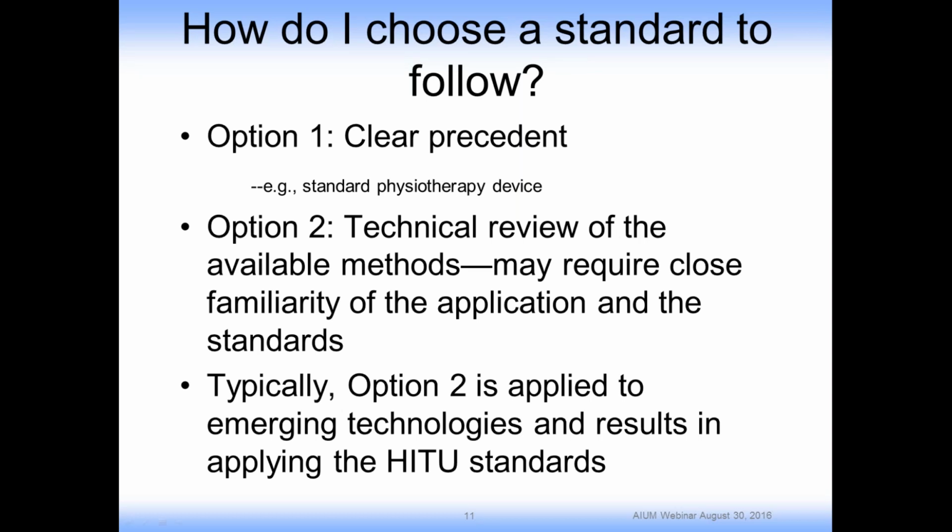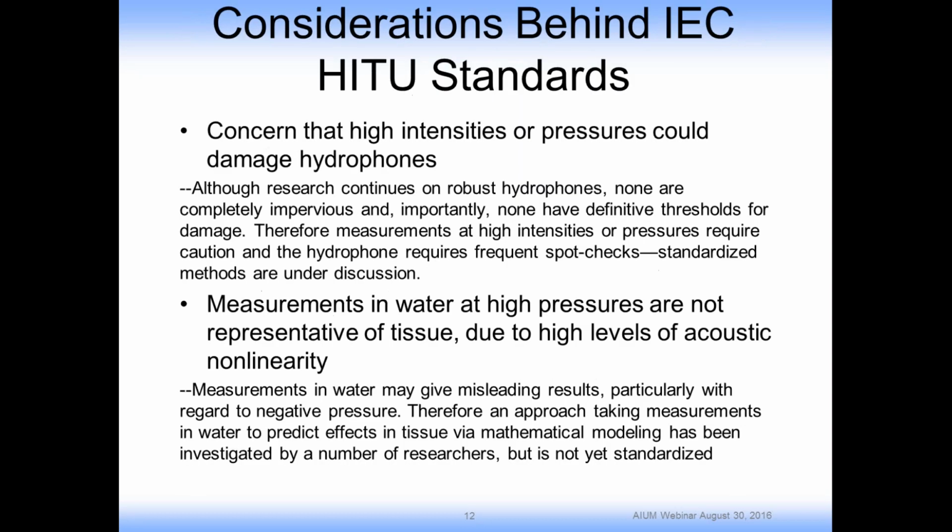Alternatively, if it's not so clear, then you have option 2, which may require technical review of the available methods. That often requires a close familiarity of your application as well as the standards. Typically, these days, applied to emerging technologies, this second option results in applying these HITU standards, which is the focus of the remainder of this talk. And so I want to first set the stage by discussing what are the considerations behind the IEC HITU standards.